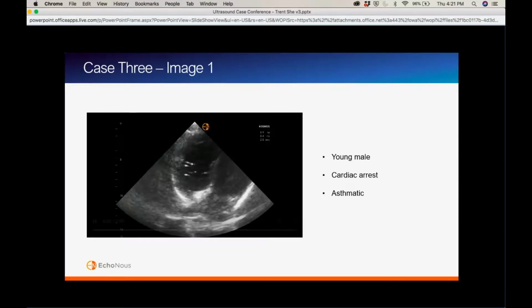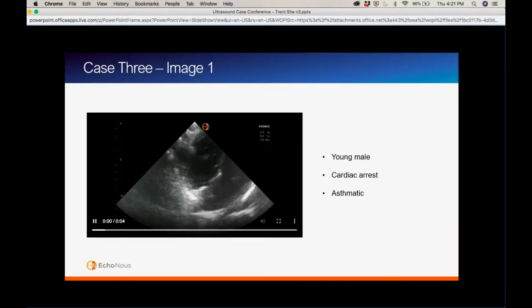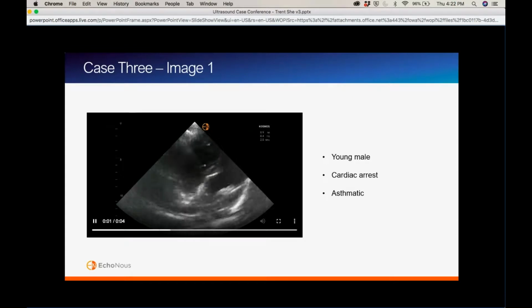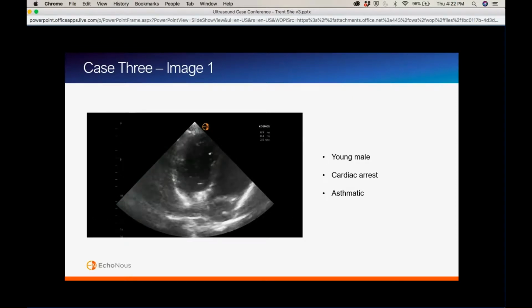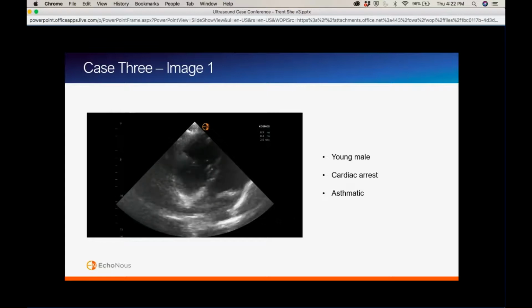And of course, pulmonary embolism, with that potentially being a clot in transit, is on our differential, and we were thinking about pushing TPA until the patient regained a pulse, and the patient is just too unstable to go to the CT scan. The other thing we were thinking it could be was that we were infusing a lot of pressors and fluids into this patient, and so we wondered, could that just be the medication we infused?